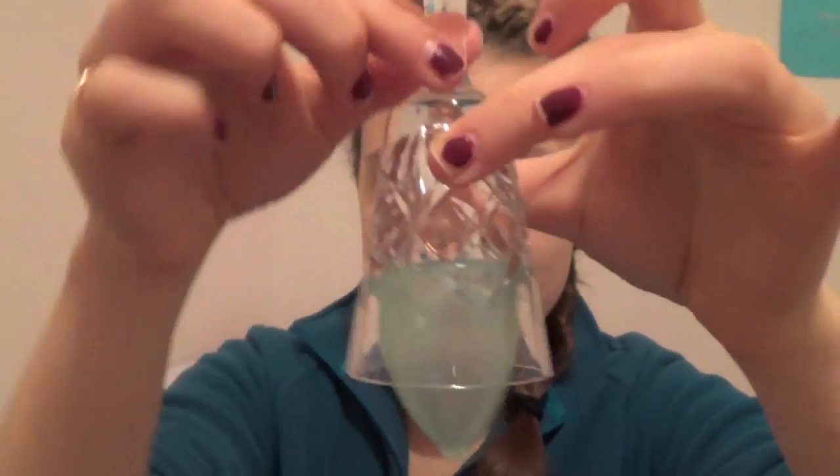So now we have formed a suction seal, and also as this glass flares out here, your muscles inside your vagina will actually hug the cup at this point. So you won't need to worry about leaking once your cup is open.